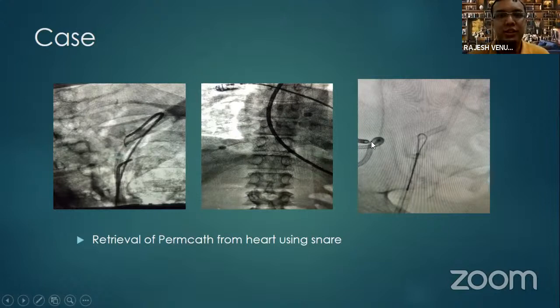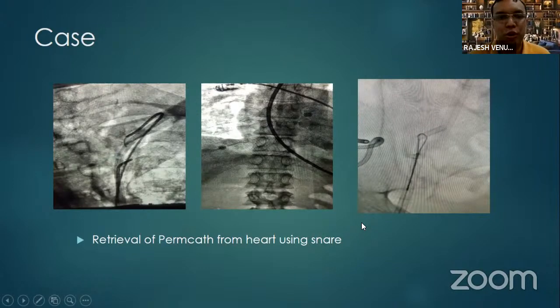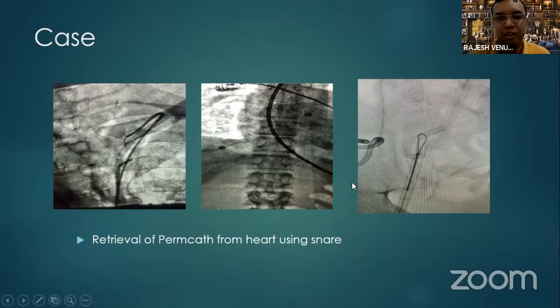The ECG lead was left in place during retrieval because any foreign body within the heart tends to cause arrhythmias — this patient was having significant arrhythmias. Once the foreign body was removed, all cardiac arrhythmias settled.